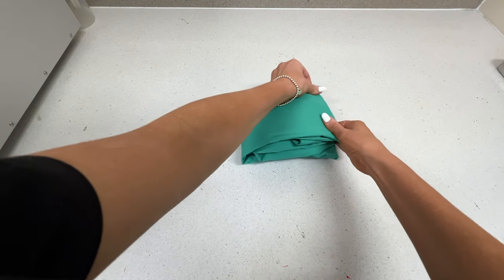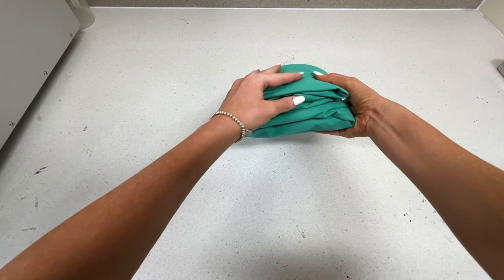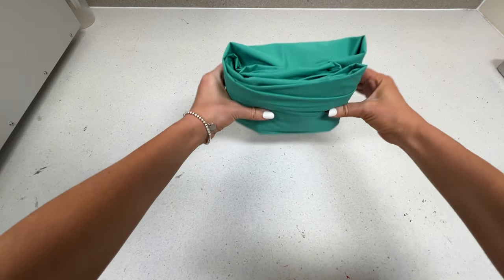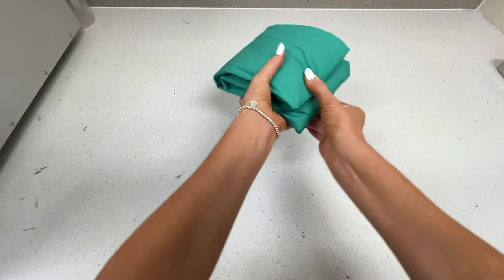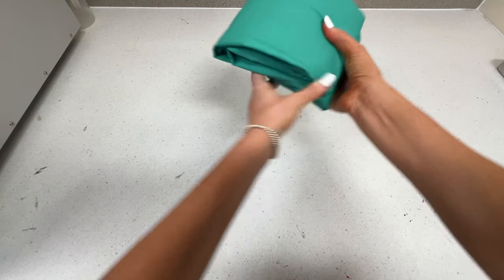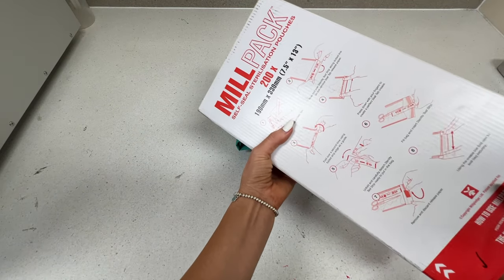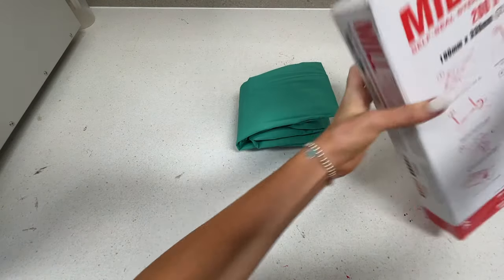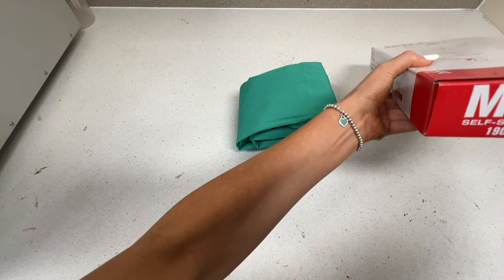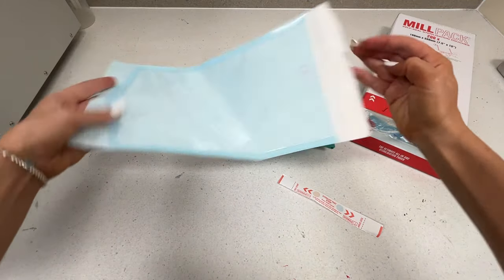I would then use autoclave tape — a decent amount so it's not going to pop open while it's in the autoclave — going from about the middle of that kit around to hold it down. I would make sure I put my initials, the date, and what kit I have just wrapped. Make sure to write as much information as you possibly can on that tape. If you are packing your surgical kit in an autoclave bag, which is quite common, you would probably use tape and then pack it into an autoclave bag.